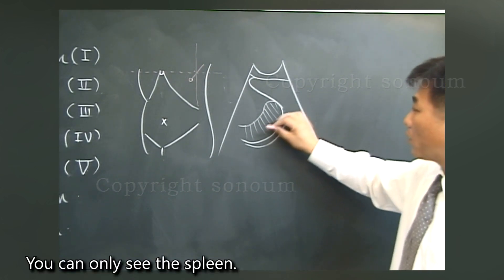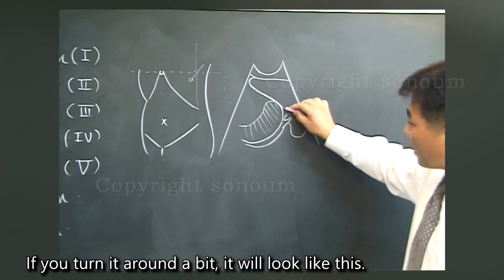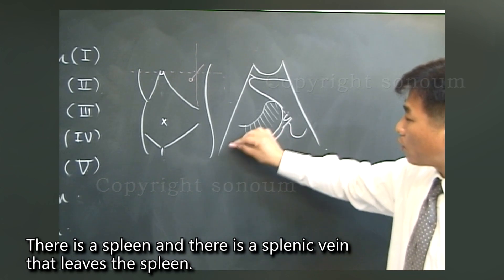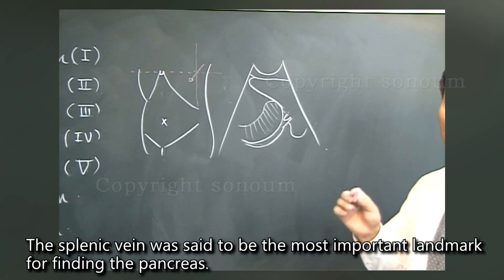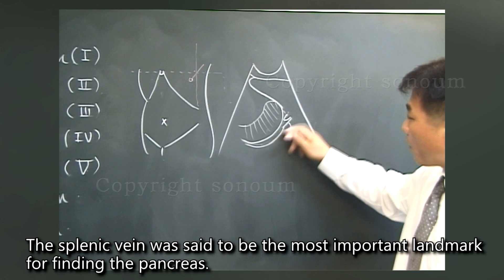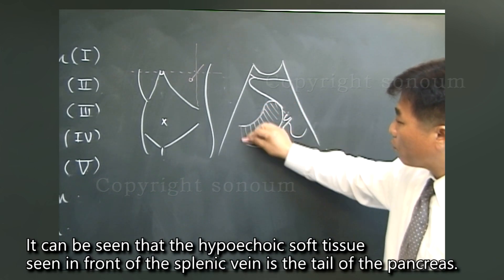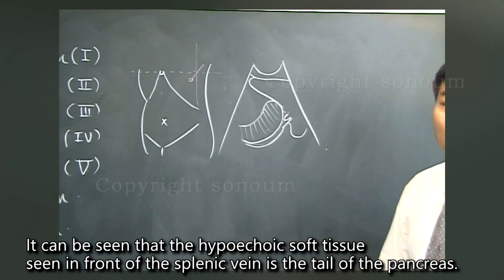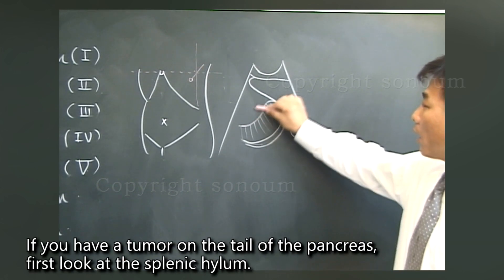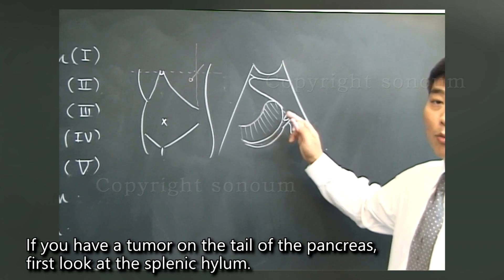You can only see the spleen. If you turn the probe around a bit, there is a spleen and a splenic vein that leaves the spleen. The splenic vein is the most important landmark for finding the pancreas. The hypoechoic soft tissue seen in front of the splenic vein is the tail of the pancreas.